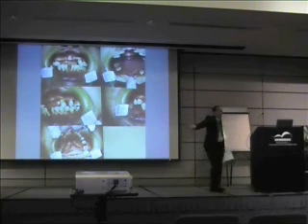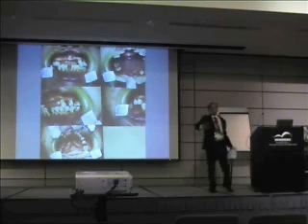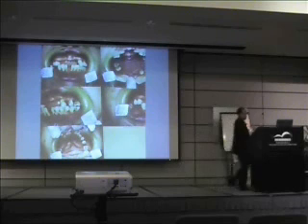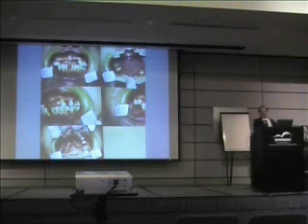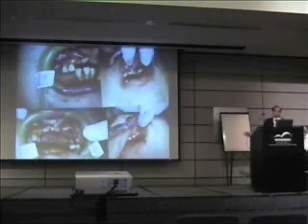Okay, we look at it. She can't afford it, she's not going to pay me much. She's going to be a minimum sort of patient that you're dealing with. And of course, if there's a patient that can afford it, there's a lot of things that you can do for her. But in this case, she's only interested in the top. There you are, I'm showing you an upper, a lower, and that's how the lower teeth are. That's the lower one, and the upper, and a side view. That is advanced, but however bad, one tooth has got to be taken out.